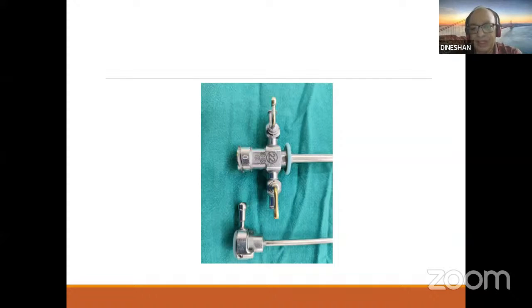sheath. But it is not actually purely circular, it is almost an oval, but the French size is always calculated as for any instrument. The diameter is 1/3 of the French size, in millimeters. And the 2 digits below that denote the largest size of the equipment. 2 equipments you can pass inside this. That is 6 French each.